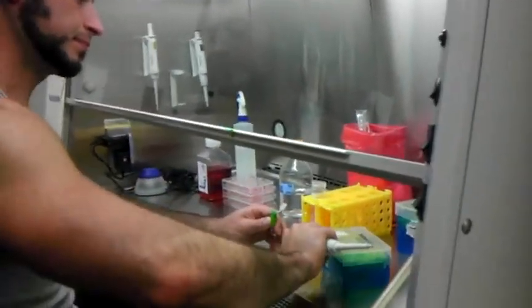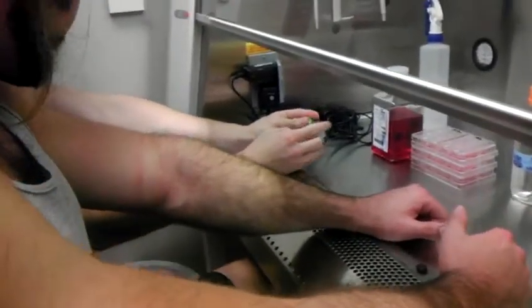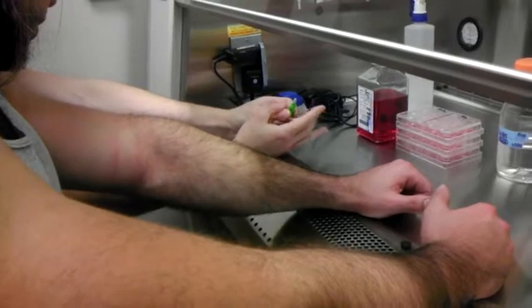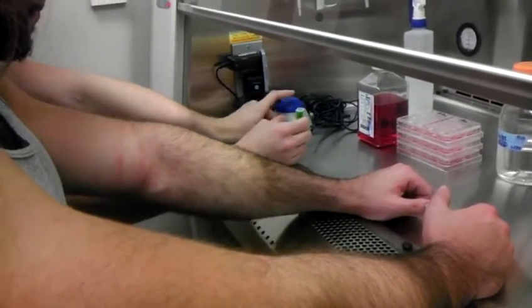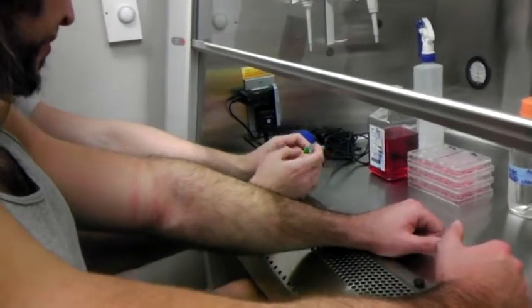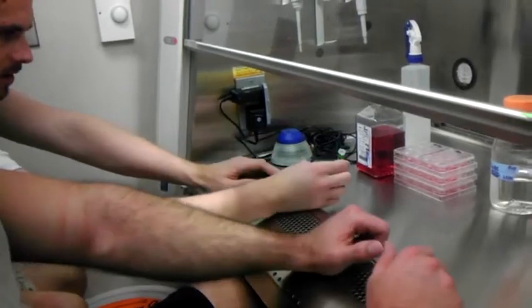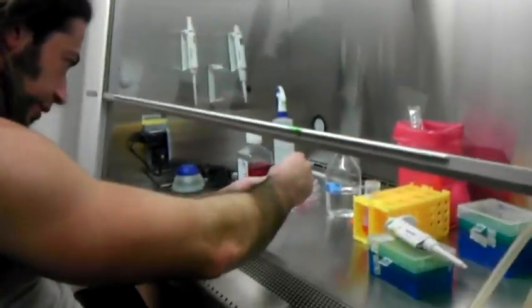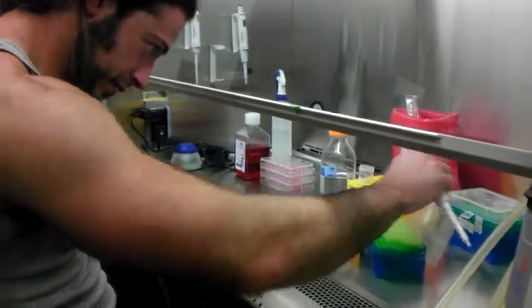The other thing is, I would recommend, let me see the plasmid real quick. You can flick it, and that mixes it up, because the plasmid will hang out at the bottom. Do not vortex it. No vortex. There you go. That's pretty good. And stick a tip on this thing.